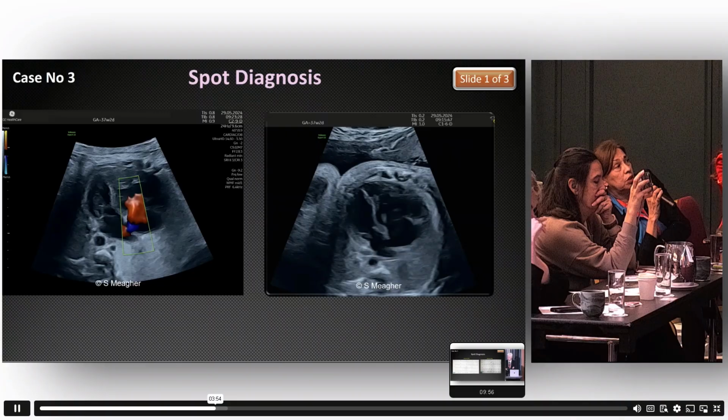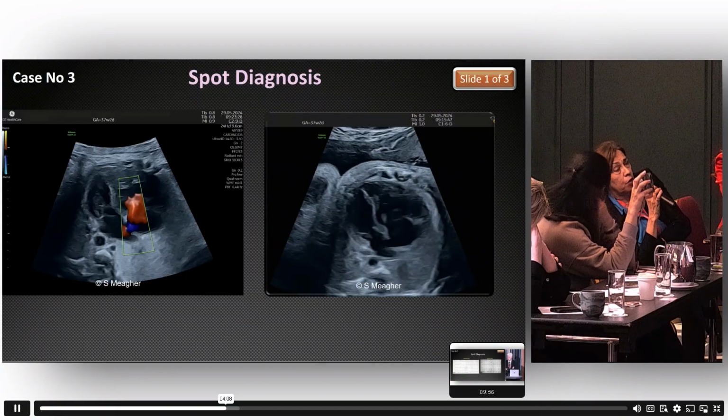And then, if the arch is still, if there is some asymmetry, I would put in place some clinical assessment of the baby after birth. You would? Clinical? Just to document. Yep. I think we're going through a phase where everyone is over-diagnosing coarctation based on disproportion. Yep. So there are lots of things that you have to look at.